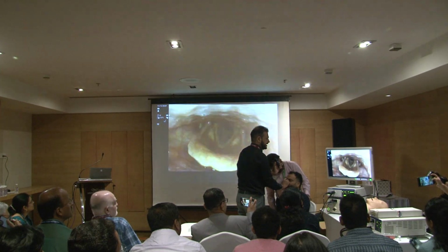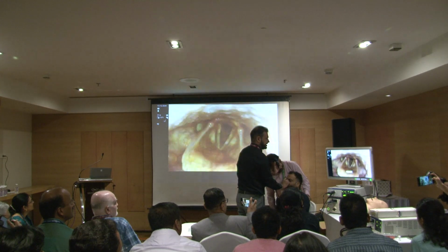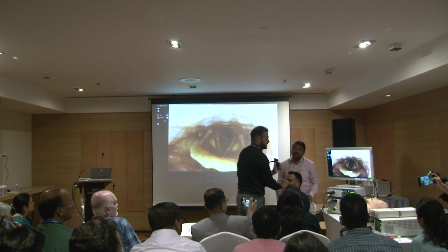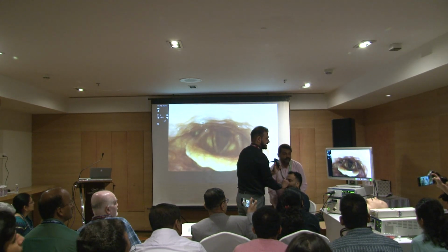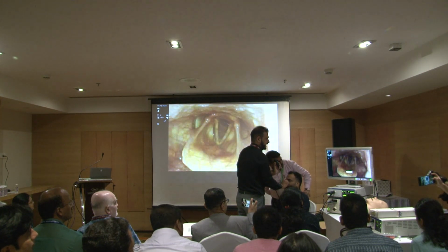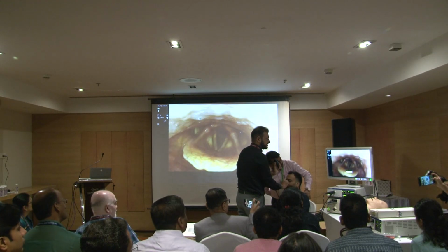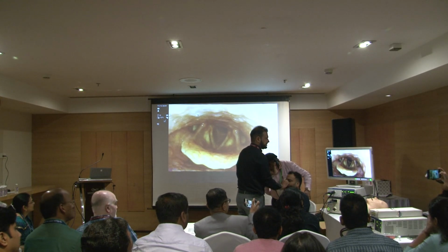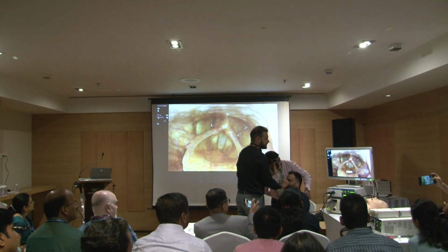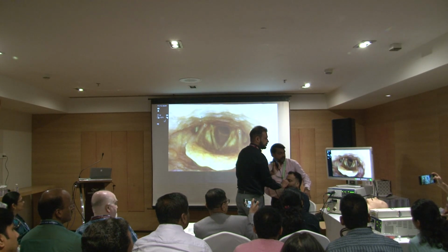Now you see that when he is saying this higher pitch, the vocal cords are getting stretched, they are getting elongated. Again, high pitch. And when he is saying this, we just saw mucosal secretion coming on his left vocal cord. Again, say. This means the effort that he has taken is much more than what it would be with normal phonation.